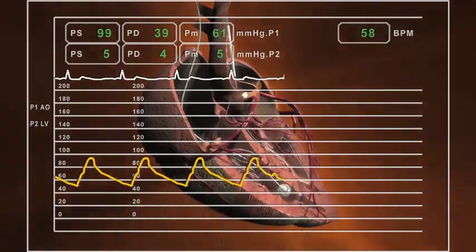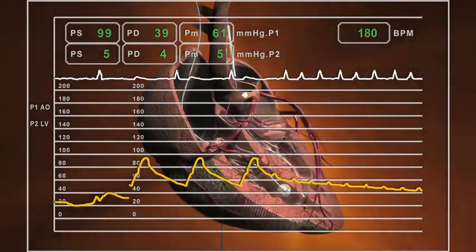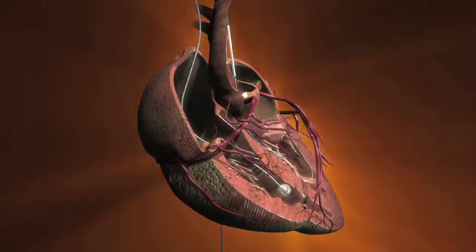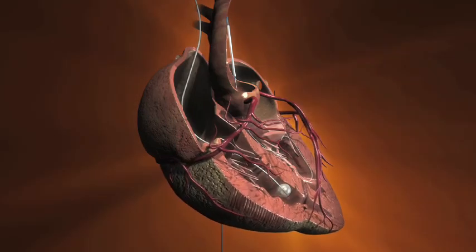Begin pacing. As shown here, a successful test is defined as 1-to-1 pacing capture with an immediate drop in pressure and elimination of the systolic-diastolic waveform. Upon completion of successful rapid pacing test, we can continue to the pre-implant dilation.